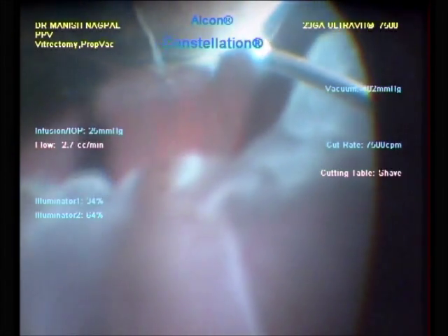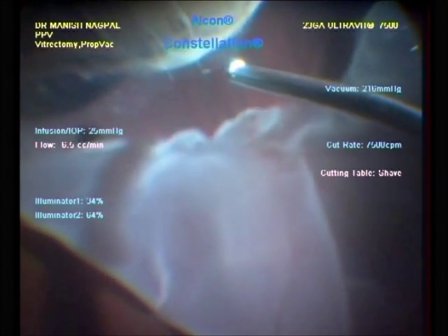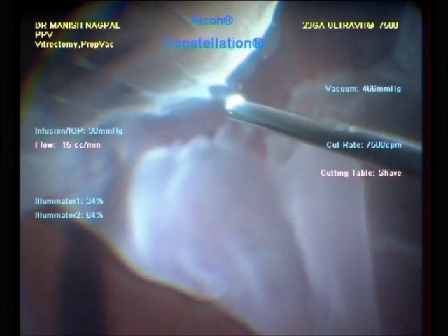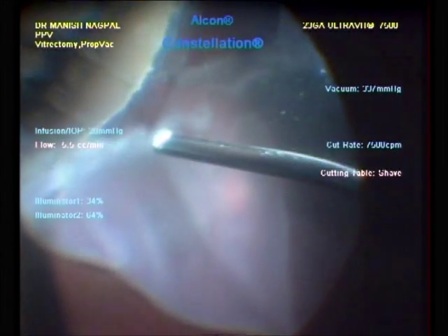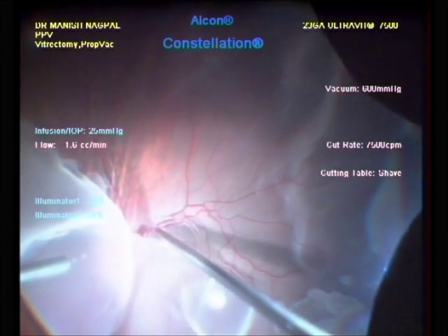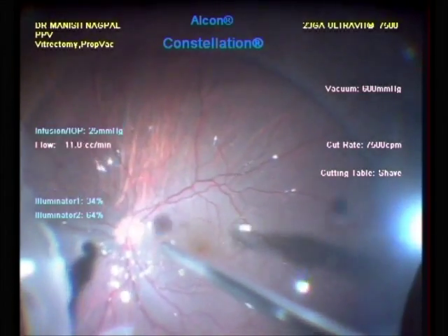Once the vitreous is removed, perfluorocarbon heavy liquid is injected to evert the flap of the giant retinal tear and flatten the retina.